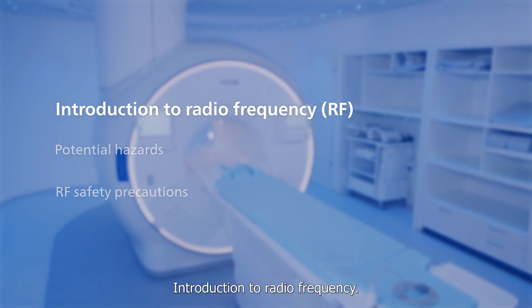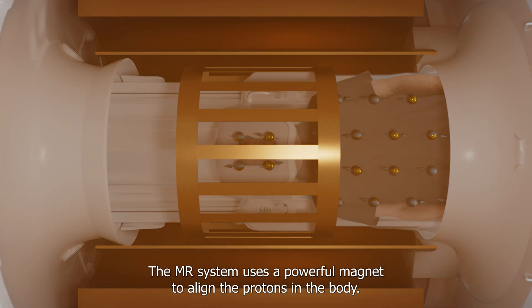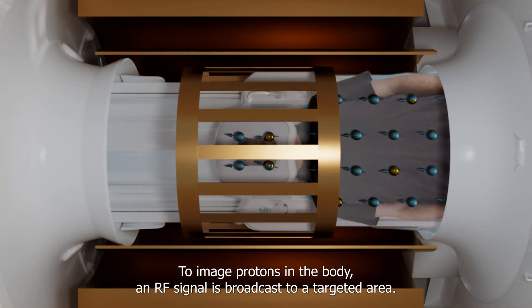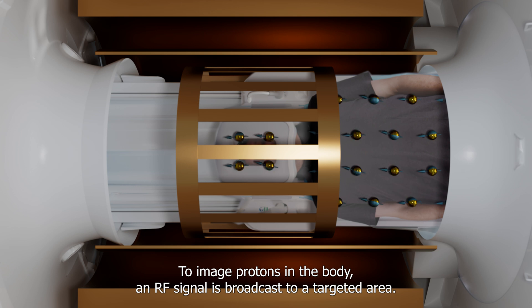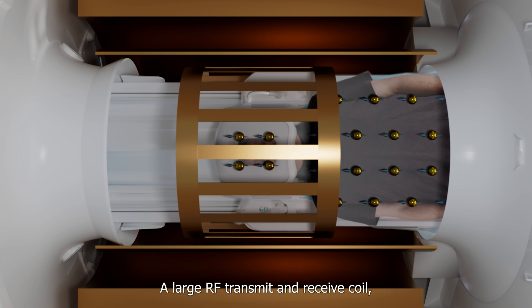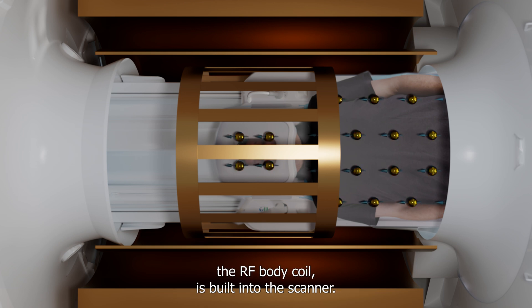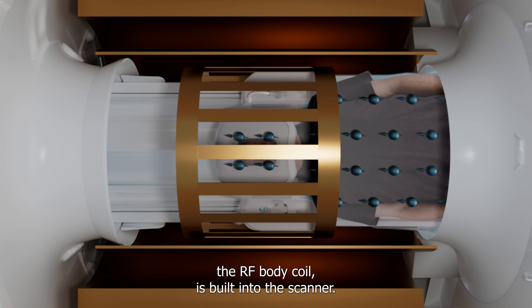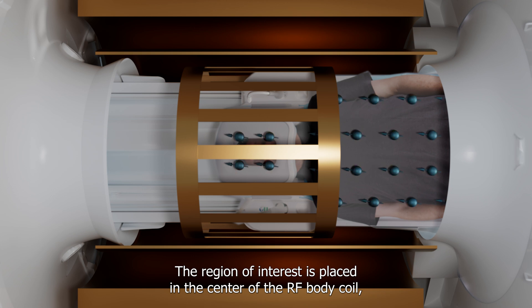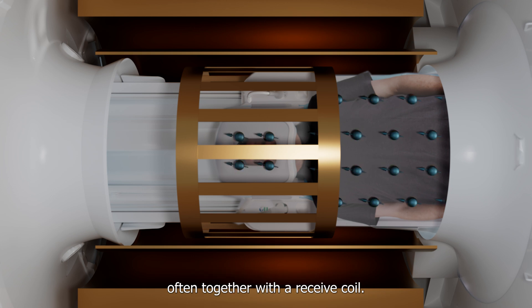Introduction to radio frequency. The MR system uses a powerful magnet to align the protons in the body. To image protons, an RF signal is broadcast to a targeted area. A large RF transmit and receive coil — the RF body coil — is built into the scanner. The region of interest is placed in the center of the RF body coil, often together with a receive coil.